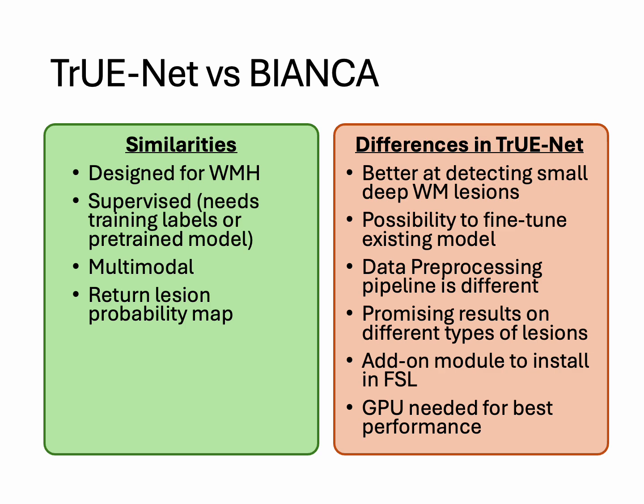First and foremost, both of them were designed for white matter hyperintensities, both deep and periventricular lesions, and both of them are supervised, which means that you need to have some manually annotated data for training. We do have pre-trained models in both cases, we'll come to that. And both of them are multimodal in nature, which means you can actually provide FLAIR and T1 modalities.